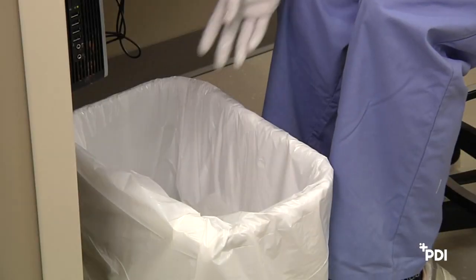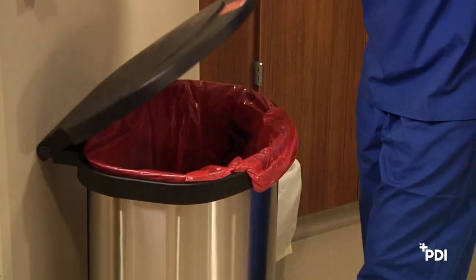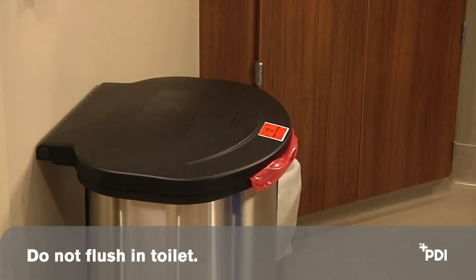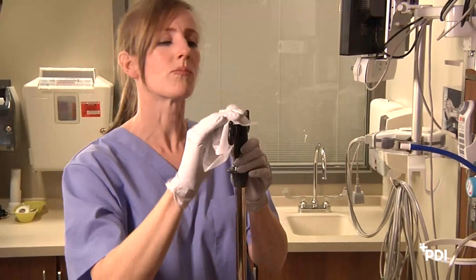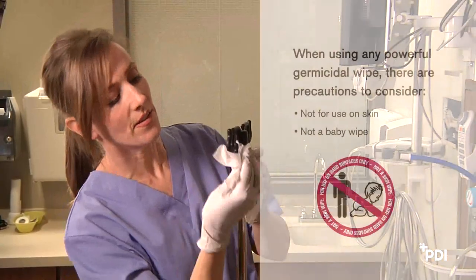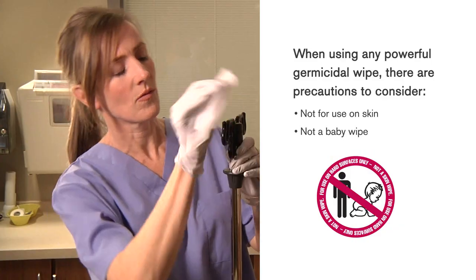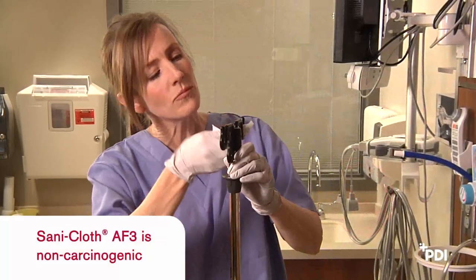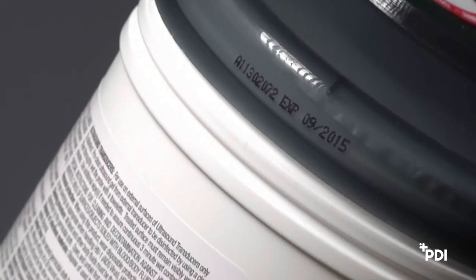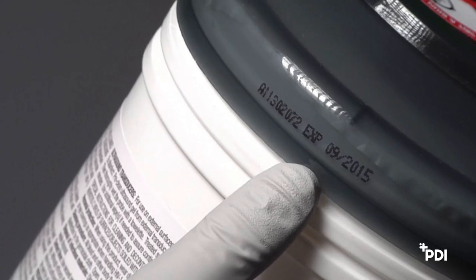Step 5: Wipe Disposal. Dispose of used wipe in trash or in accordance with your facility's regulations for infectious waste disposal. Do not flush in toilet. Do not reuse the wipe. When using any powerful germicidal wipe, there are precautions to consider. These wipes are not for use on skin — this is not a baby wipe. SantaCloth AF3 is non-carcinogenic and has a two-year expiration date that is stamped on the product.